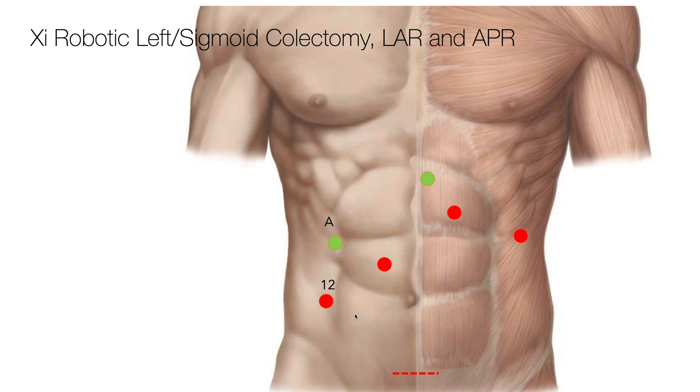Then I place the next robotic trocar, which is an eight millimeter trocar, basically in a line with the other two. It goes about in the middle of the rectus sheath, and then the last robotic trocar would be in a straight line with those, except that the rib margin comes in the way, so I have to come down because of that.